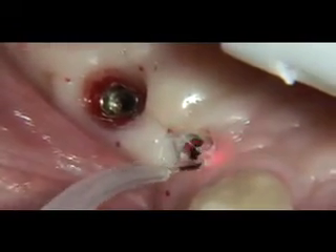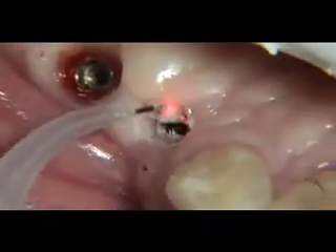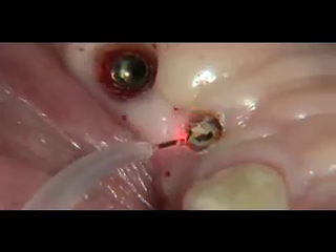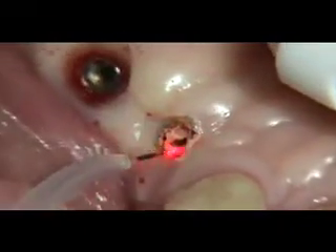Excessive gingival tissue that is allowed to interfere with the implant-retainer interface results in an improperly seated retainer. Retainers that are not fully seated can eventually become loosened by occlusal forces, resulting in unstable restorations.